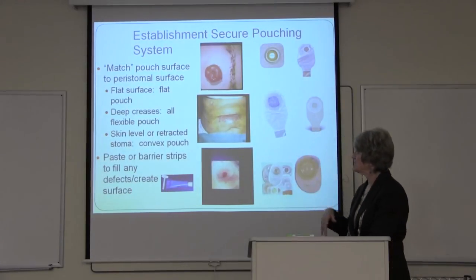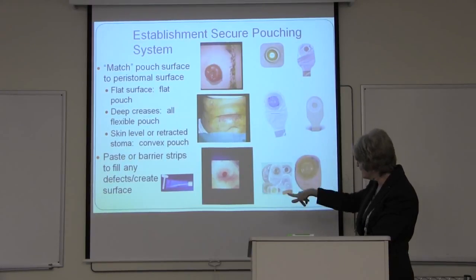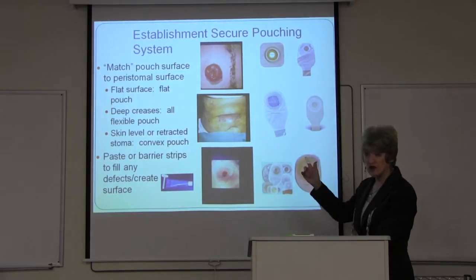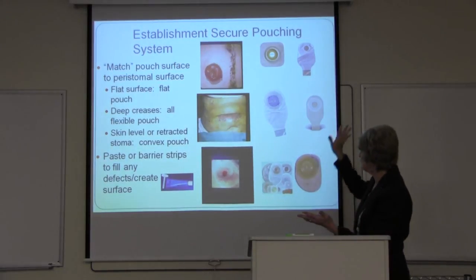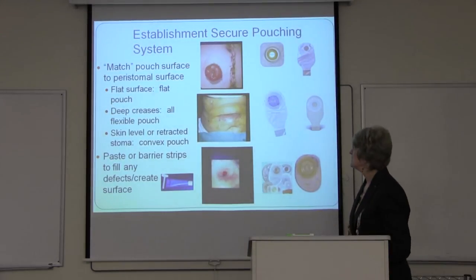Okay, so we talked about matching the pouch to the abdominal contour. So here's three slides that show you exactly what we're talking about. The stoma on top, you've got a nice flat surface. You can use a flat pouching system, and you'll be very effective.